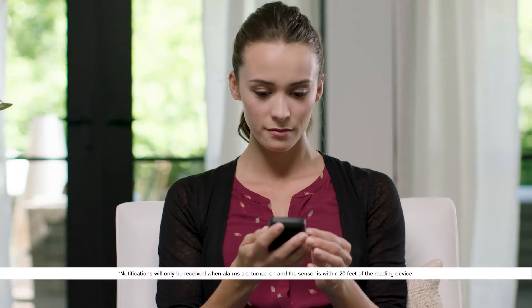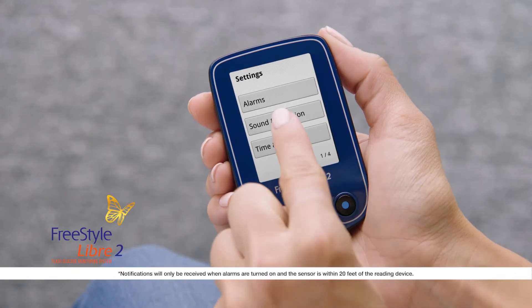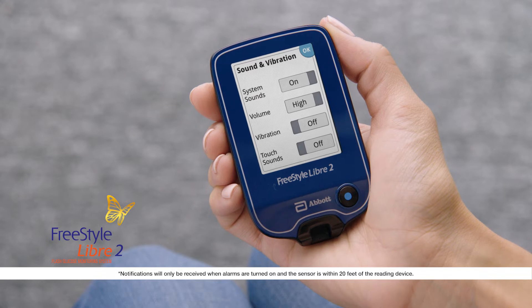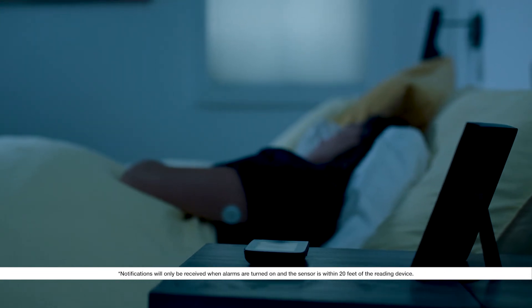Now we'll set the alarm sound and vibration levels. In the settings menu, touch sound and vibration to see your options. You can choose on or off for system sounds, which includes your alarm sounds. You can also set the volume level. Choose on or off for vibration. When the alarm sounds or vibrates, the reader alarms for about one minute.